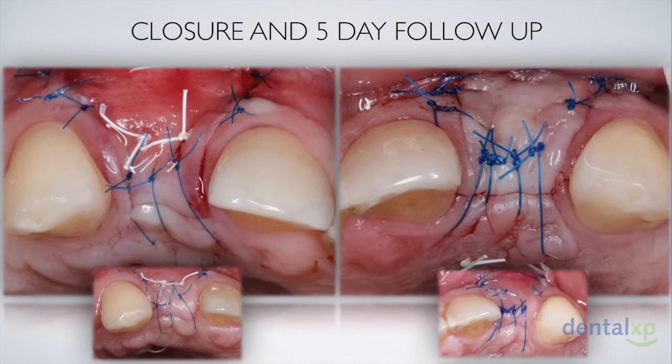So we have the closure and 5-day follow-up for both sites, and we know that a prerequisite to ridge augmentations is tension-free primary closure, and that may be easier said than done in some cases. So what I do in addition to the periosteal release is some modification in my suturing technique. I start with an initial deep horizontal mattress suture, as you can see in the top left picture. This is usually a thicker gauge suture, maybe a 4-0 Gore-Tex suture. Then I proceed with vertical mattress sutures more coronally, however not in close proximity to the edges of the flap.